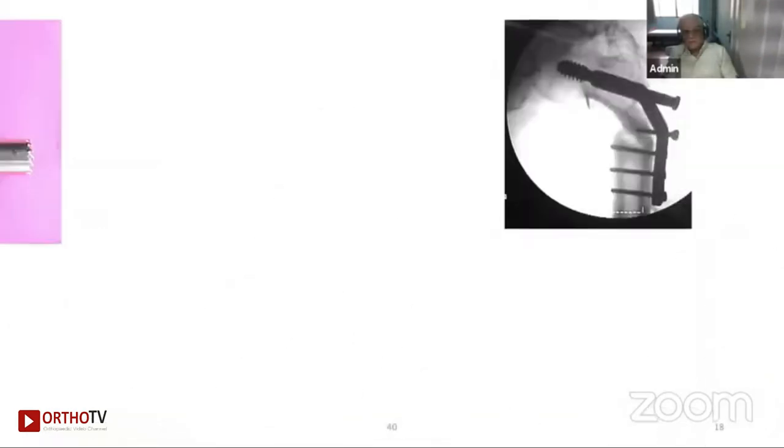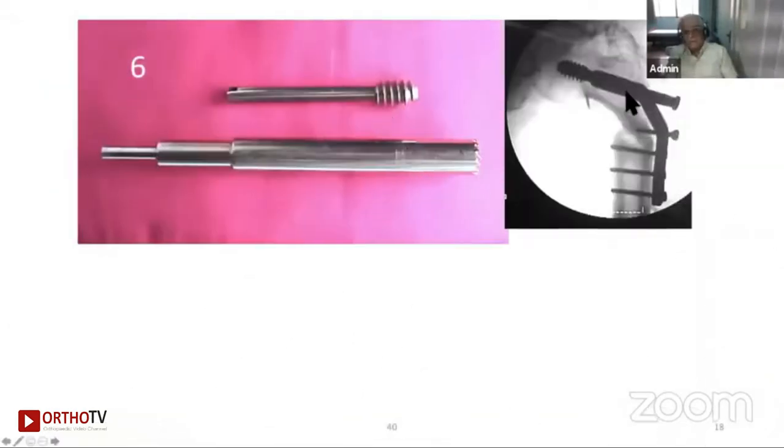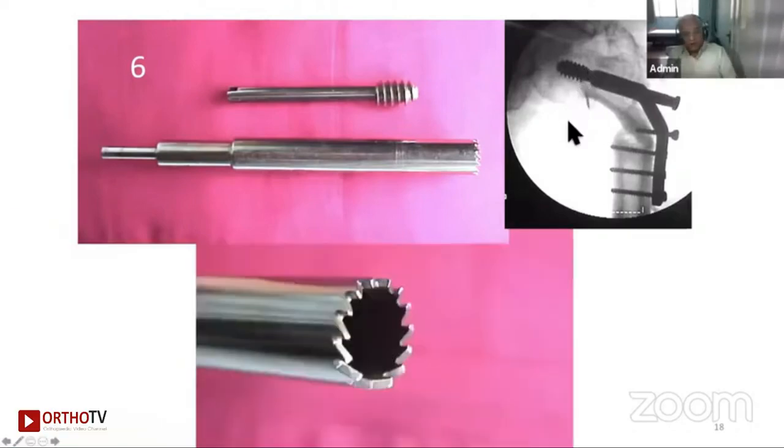Now here is the case of DHS removal. If this DHS is jammed, this is the hollow mill which can go onto the DHS. At times, after many years, the DHS gets jammed because bone formation occurs inside. When the bone formation occurs inside, you cannot take out your DHS. So here it is.